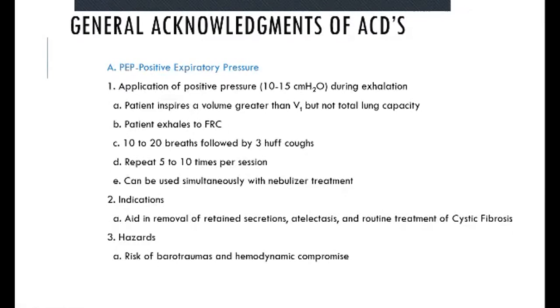Okay. PEP therapy. Application of positive pressure, usually 10 to 15, that's usually what we start with, 10 to 15 centimeters of water during exhalation. The patient inspires a volume greater than tidal volume, right? Just take a deep breath in and they exhale to FRC. You're not forcing, okay? Because if I'm forcing, I'm doing vital capacity, right? Just to FRC.